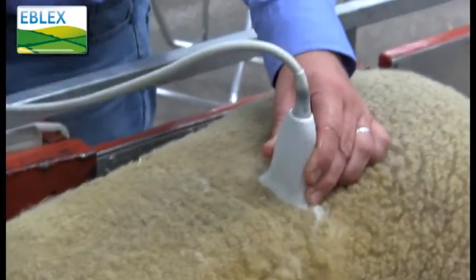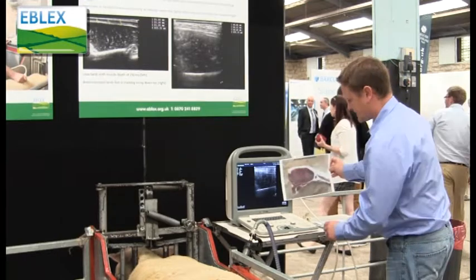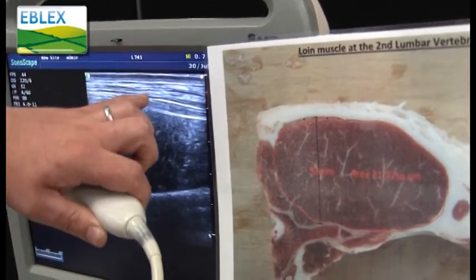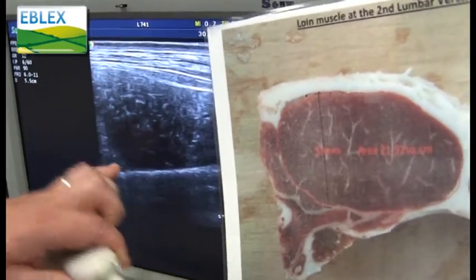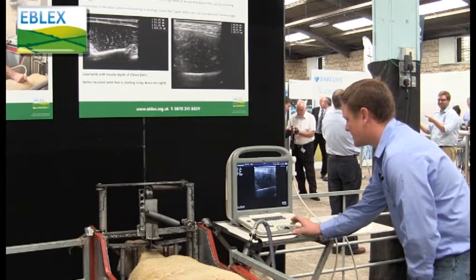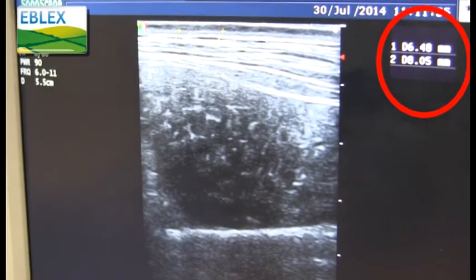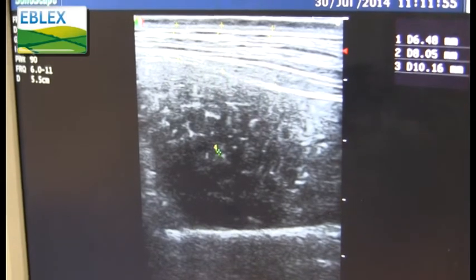We apply the ultrasound head to get the image of the eye muscle. We're basically looking at the bone, the fat layer at the top, and the muscle in between. On every lamb, we take three measurements of fat depth in line with the deepest point of the muscle for the first measurement, and we do those at centimetre intervals for consistency.